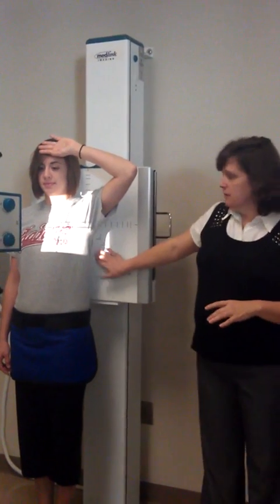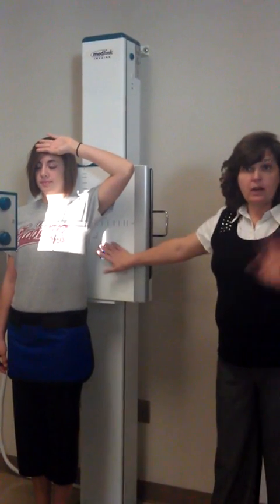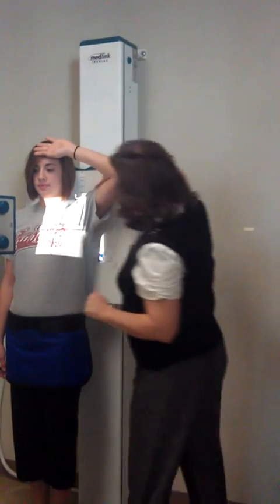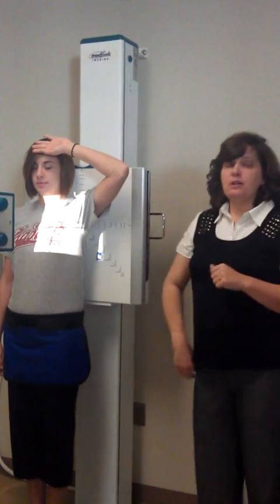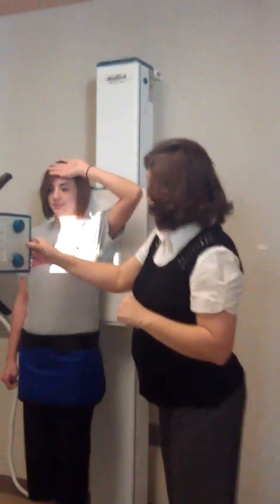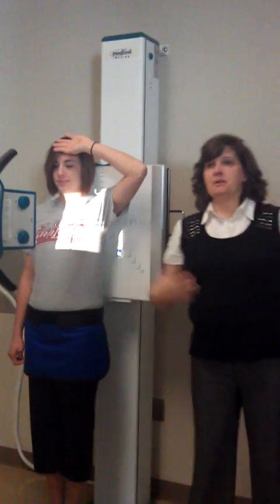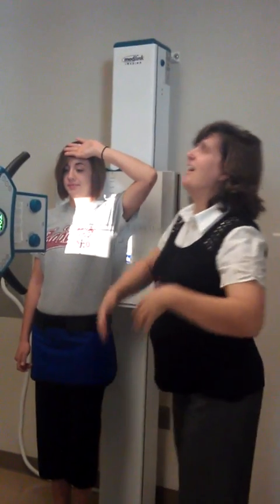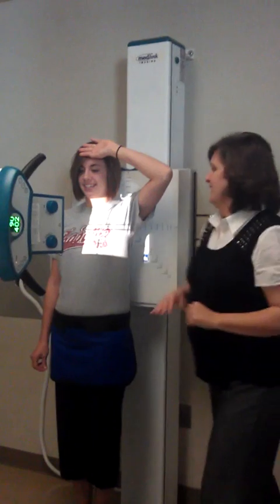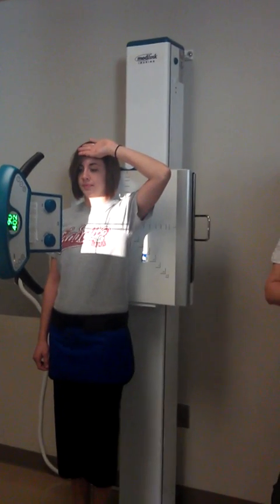We have light down here, and her shirt's kind of in the way too. So we have plenty of light — we're not even in any of that. We also have some light up here. We could have put it with Joel, but we didn't because he's muscular on top. As women, unless you work out, it's different. So this is our empty setup. Any questions?